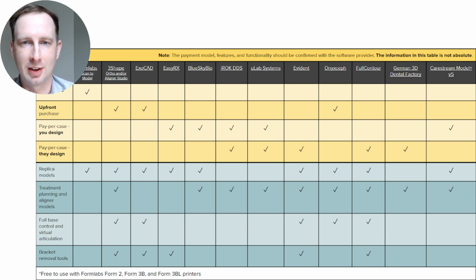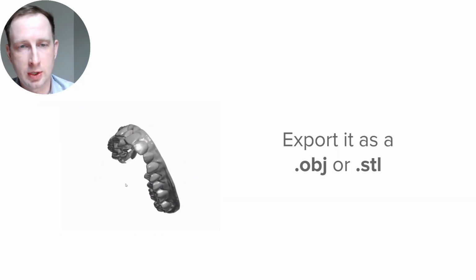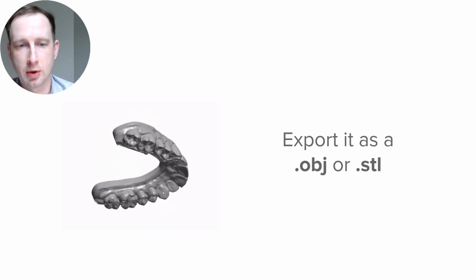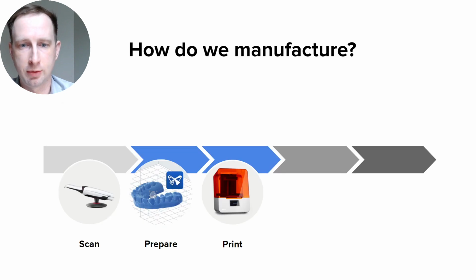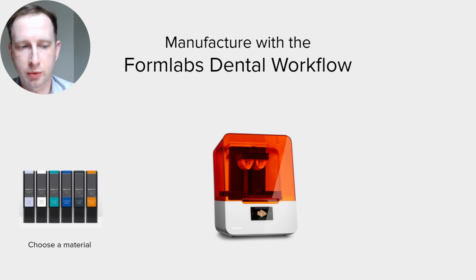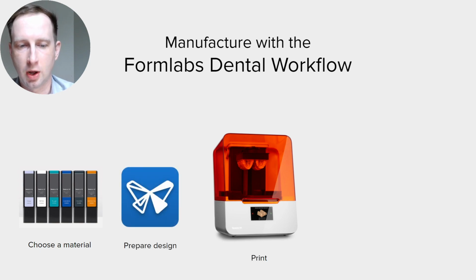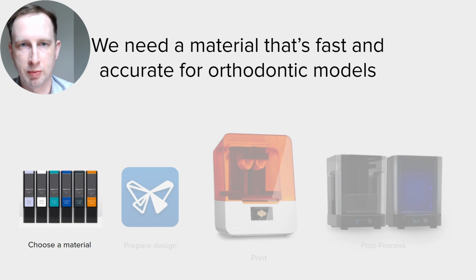Q1, early 2021. So if you're using one of these dental CAD softwares, say like 3Shape, you need to get your manufacturing files, your model files, exported as an STL file to bring into Preform. And how do we actually manufacture it? Well, we bring those files into our Preform software, but before that, we need to choose a material that's appropriate for what we're doing, bring those STL files, those manufacturing files into Preform, set them up, send it to the printer, you print, wash, and cure, and then you're ready to make the appliance.